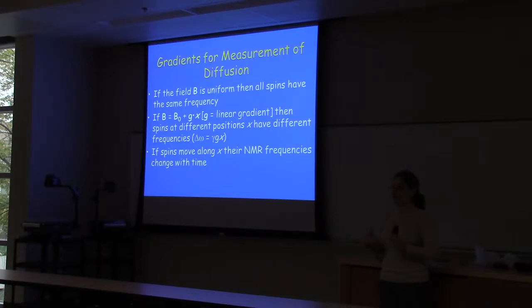So if one of you were to get up and kind of move to the back and grab a drink, your frequency will change with time as I'm doing the display, or the model, the image, and we won't quite get a nice image. So this was something that they studied way back when as something that was bad for the image and going to cause problems. But that's when Dr. Moseley found those stroke images, and it turns out this can actually be really good. And it's much better than we originally thought.